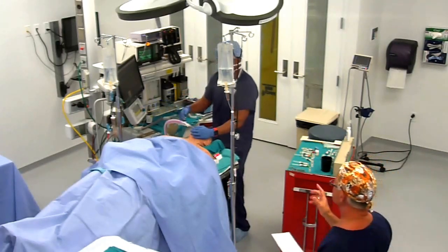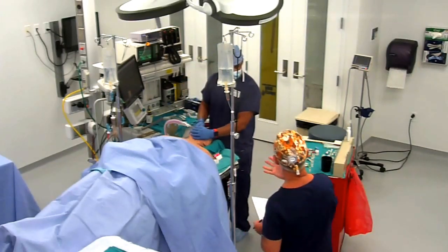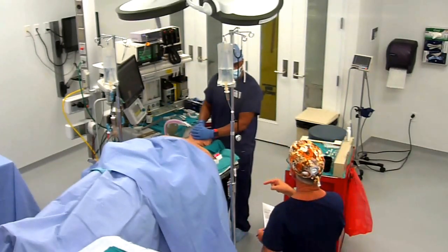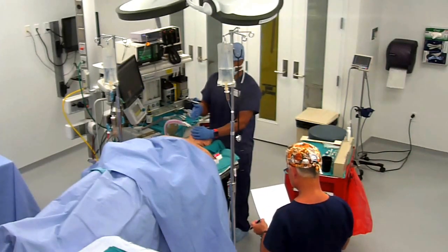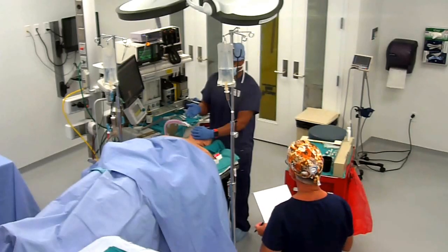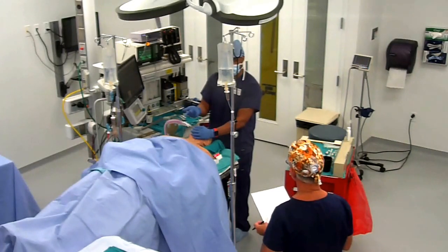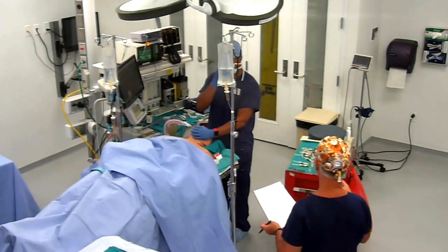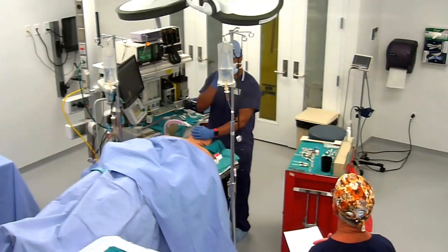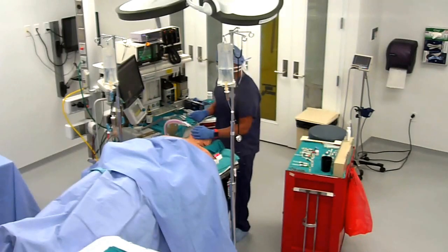So she's having an abdominal procedure, and you ventilated her before you did your intubation. Is there anything you want to do before they start down here? Yes, right before incision, I want to give extra pain medication because that's the most stimulating thing we do besides the intubation, the surgical incision. So I want to pre-medicate the patient. Okay. And since you were ventilating by hand, it's very possible you got some air in the stomach. So I want to place an NG tube. Okay. I want to decompress the stomach. Okay. So NG tube to LIS.